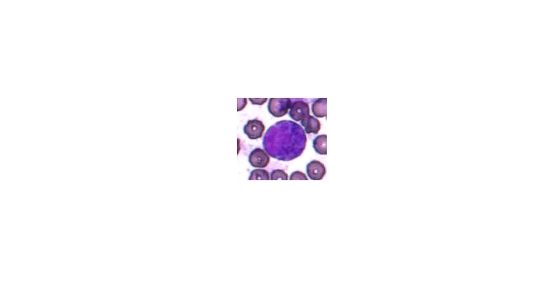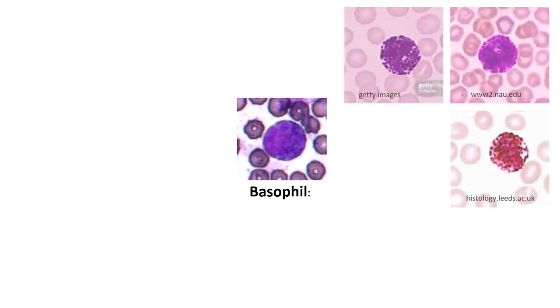Finally, let's look at the basophils. They are the least common type of white blood cell, and they are rarely seen in our images. The additional examples provided here are not from our images because we don't yet have many good basophil images from our slides. Even though you're not likely to see any of these cells, you should know their identifying characteristics.